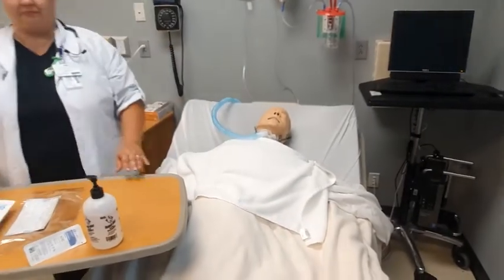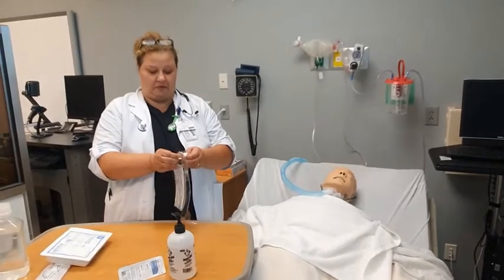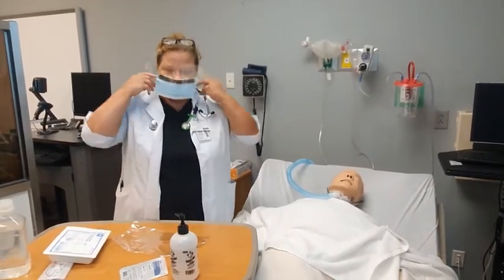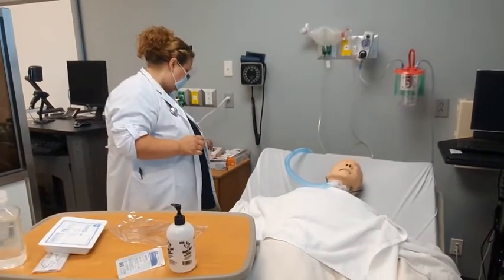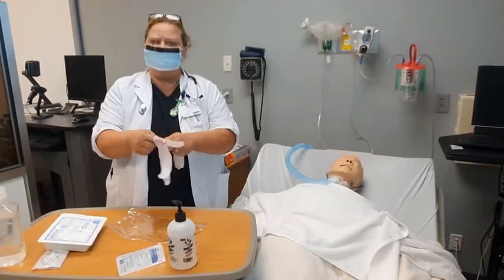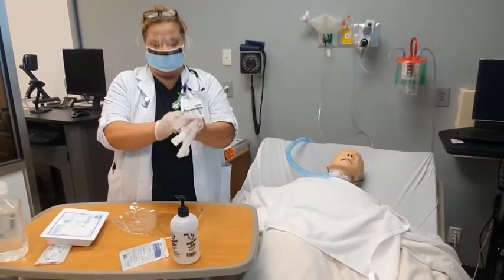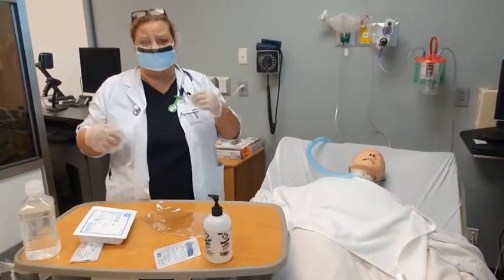Then go ahead and put on a mask with eye shield, non-sterile gloves, and other PPE if you think there will be exposure to bodily fluids. So right now, of course, I'm going to put the mask on. Like I said, there are gloves inside the room that you will put on. If I got in here and he was having lots of secretions, coughing and sputtering a lot, of course we would suction him, but I'd also probably want to put a gown on so I didn't get contaminated. And this is when you would do that.